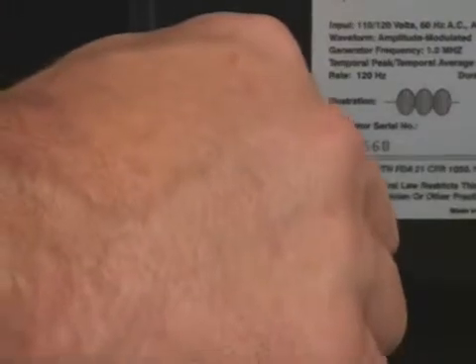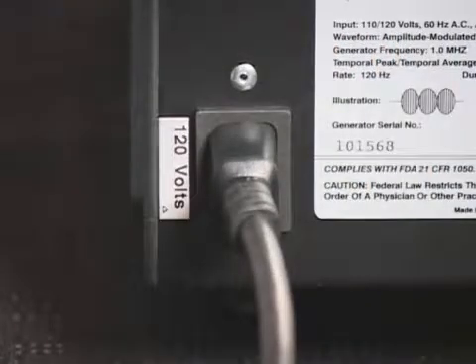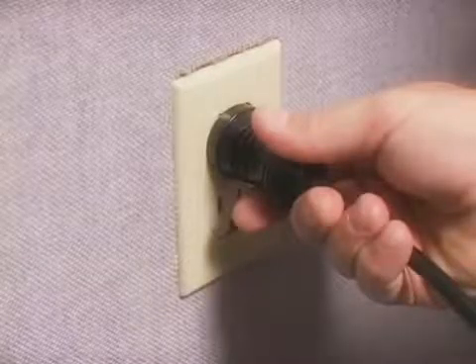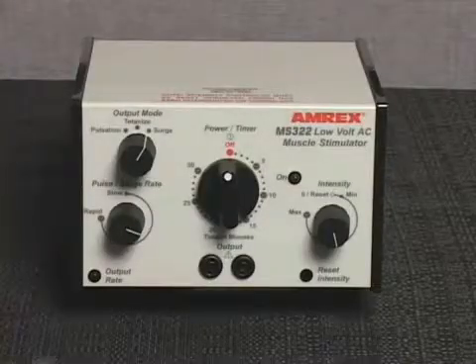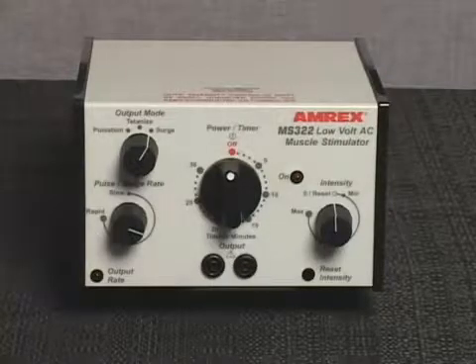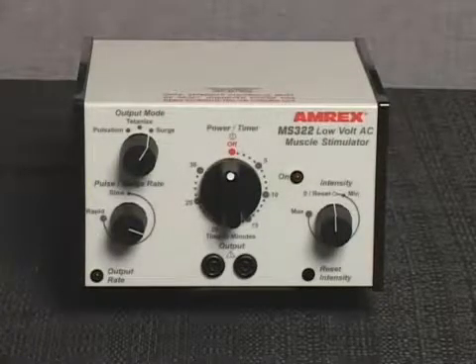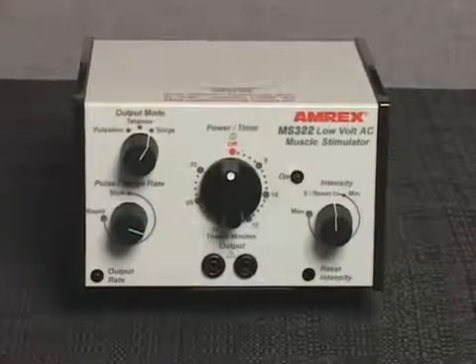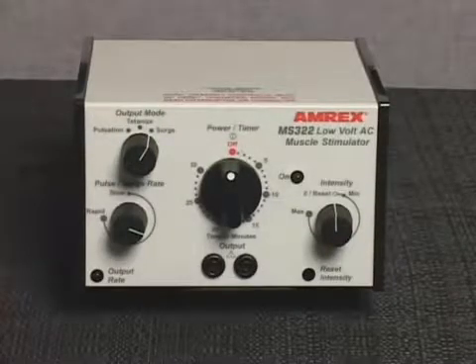In order to operate the MS322, you must first connect the power cord to the AC receptacle on the back of the unit and insert the power cord plug into a properly grounded AC receptacle. Rotate the intensity control knob to the zero reset position, enabling the audible click.